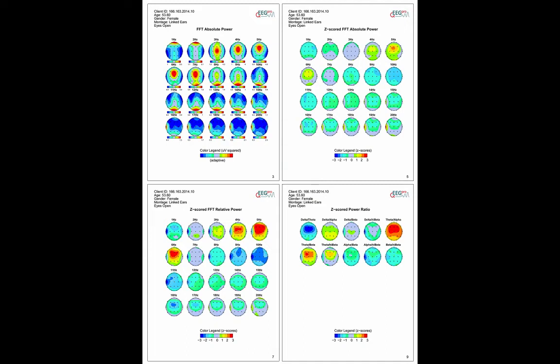QEEG Pro reports contain absolute power, relative power, and power ratio analysis. Both absolute power and relative power analysis consist of discrete frequency bins ranging from 1 to 40 Hz.